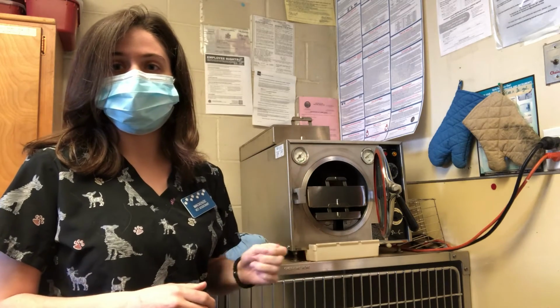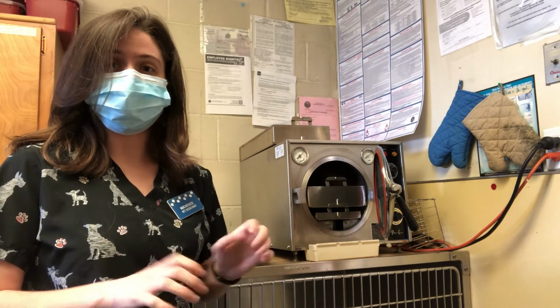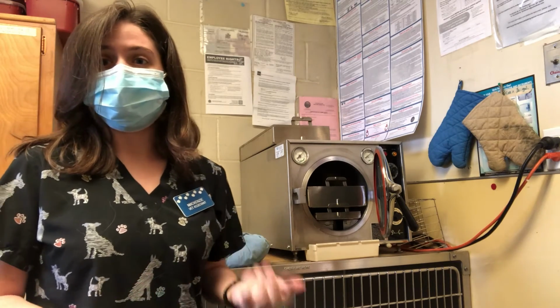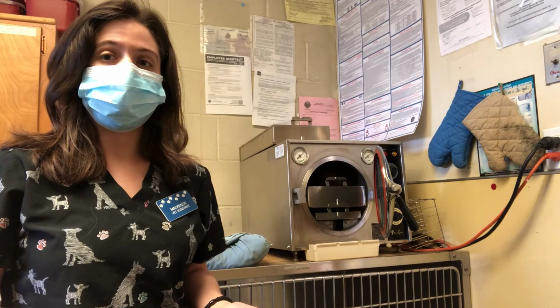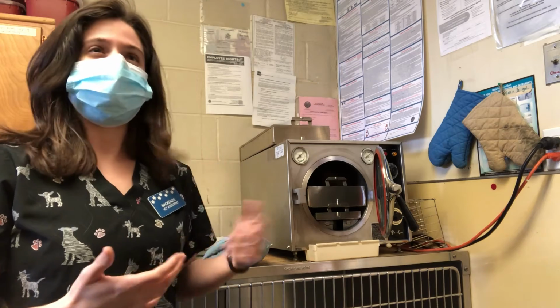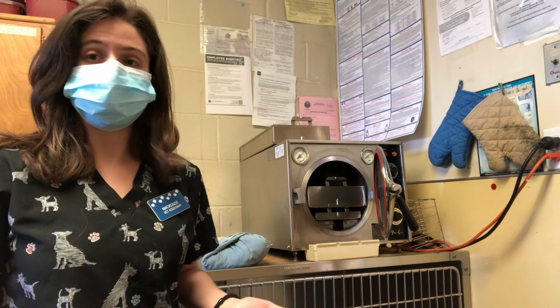And the way an autoclave works, or at least the way this autoclave works, is that the water will be electronically heated and turned to steam, which will be forced out of the machine through a port. And then once that happens, the steam pressure will build until it reaches a specific temperature, and then that's when the sterilization process will begin. Once the cycle is complete, the steam will actually condense back down into water, and then the machine will cool down, and then we can take the packs out, and they should be properly sterilized.